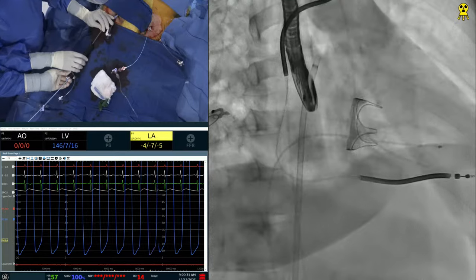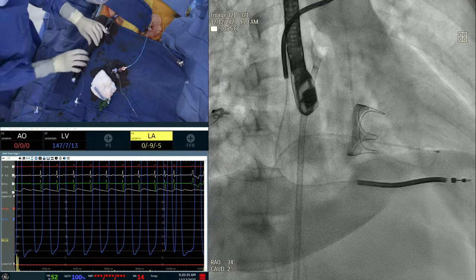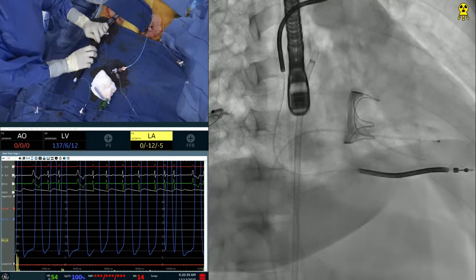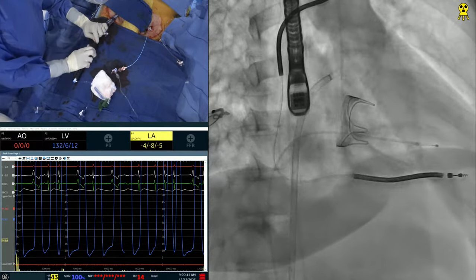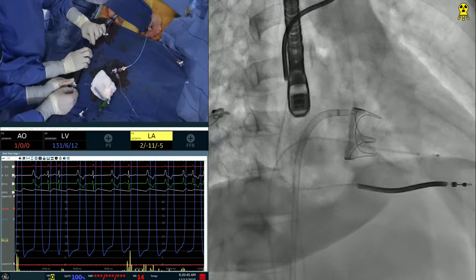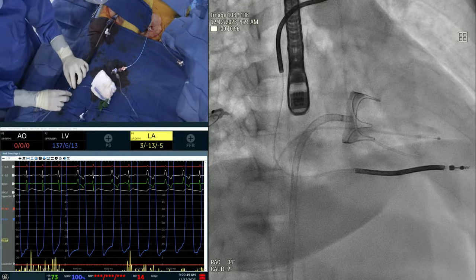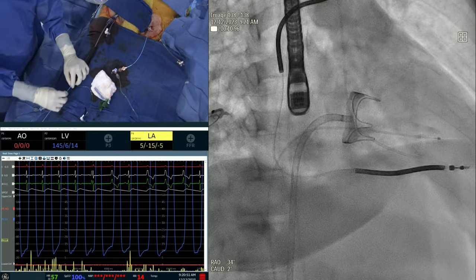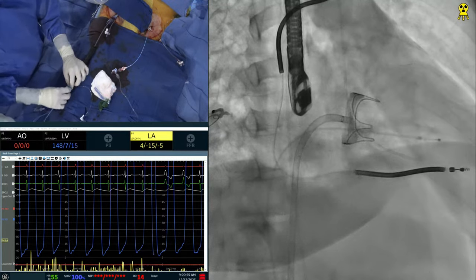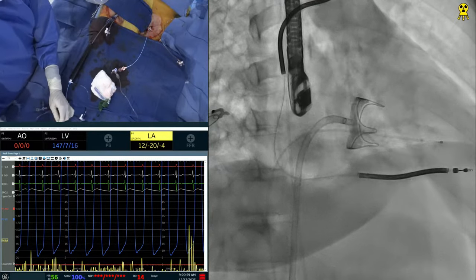You're in the pulmonary vein, as I say. So get us a multipurpose catheter and wire, please. Let's try J only now. Okay, so RAO view. So we deflect it, face it into the... It looks like it's ready to go across the mitral valve already, your HLS sheath pointing very nicely. Yeah. So it also tells you what your trajectory is here at this point.